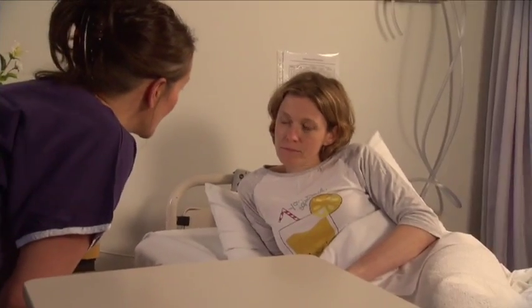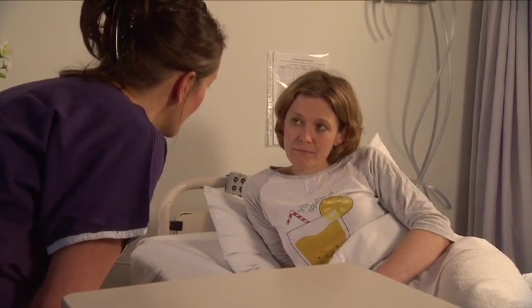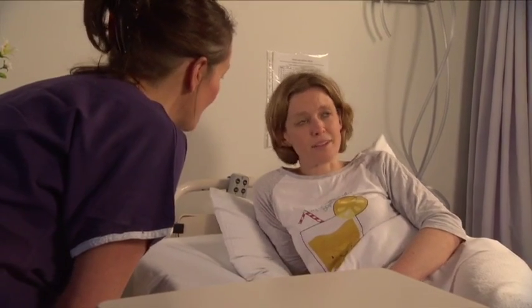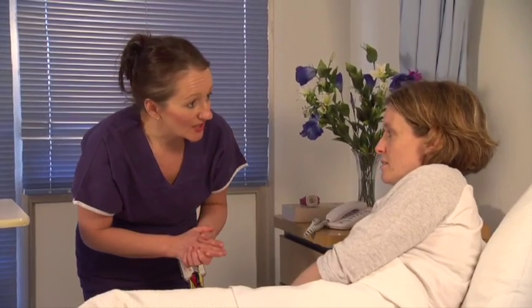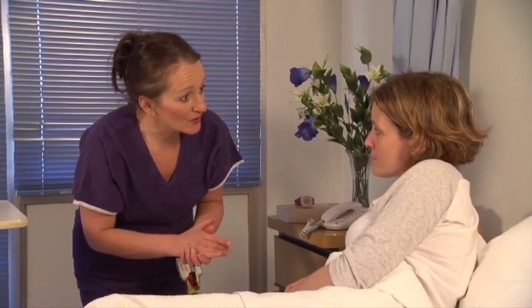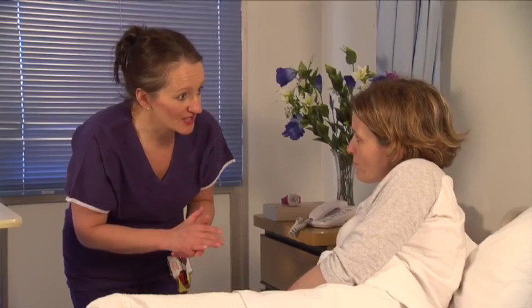Did your doctor explain to you that we needed to do this? Look, he did, yeah, but I'm just wondering if I can take a tablet instead. At the moment, we need to give this medication directly into your bloodstream so that it will work rapidly and effectively. We can switch you to tablets once we're happy with your progress. Okay. We do need to make sure that we take good care of this arm while the IV's in, so we'll need to know from you the minute it gets sore or red. And you can talk to your nurse or doctor about that at any time. How long do you think it's going to stay in for? A maximum of 3 days.